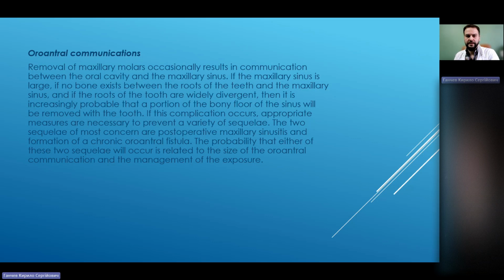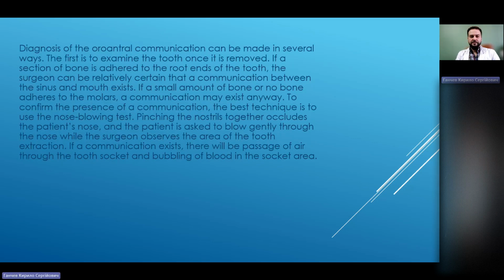Let's move to oral antral communication, the most dangerous and most problematic one, when we have removal of maxillary molars occasionally. It could result in communication between the oral cavity and the maxillary sinus. Not a good situation. So you have to know how to manage that. So the first thing that we have to do is to examine, sorry, the tooth once it is removed.